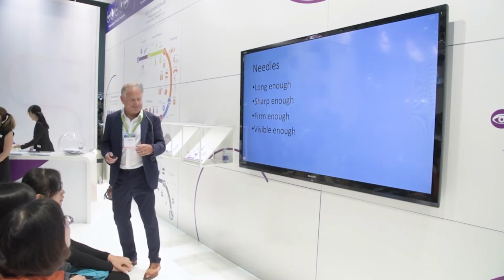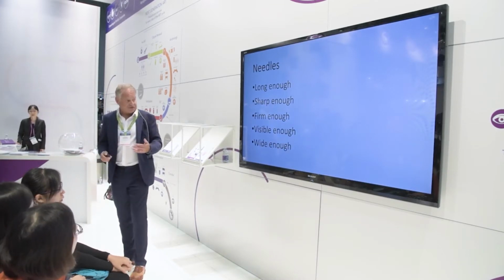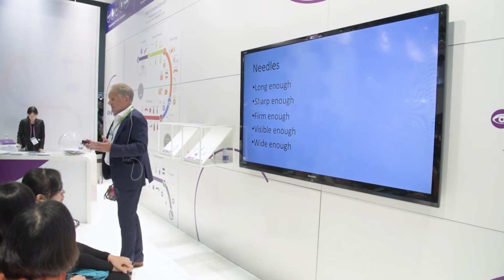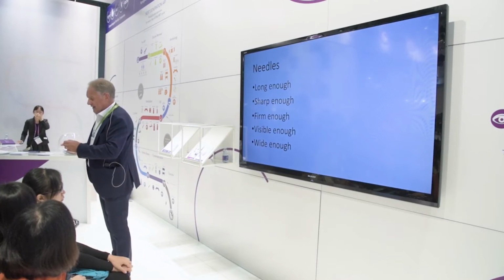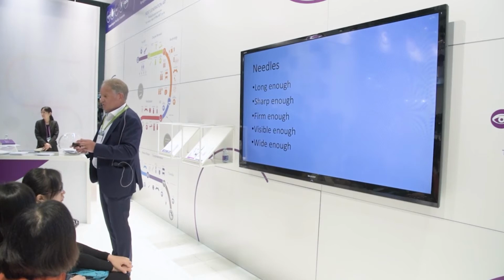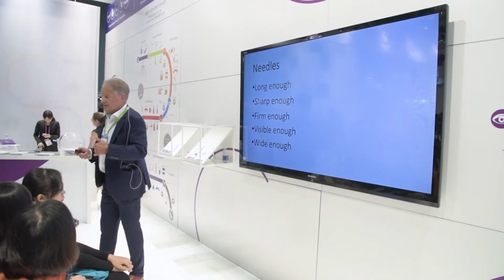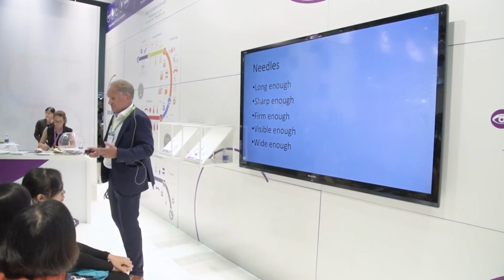But something, going back to my MD thesis, which I found extremely important, it had to be wide enough. We used to use 14 gauge needles in the mid to late 1980s with a flushing arm and an aspiration bore that were very wide. We didn't have the benefits of anesthesia or intravenous sedation, so the majority of patients were sedated with Valium or Pethidine. Now, as you know, Pethidine is not the best painkiller.